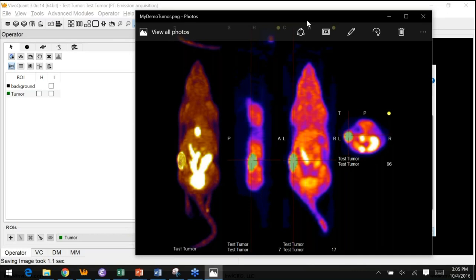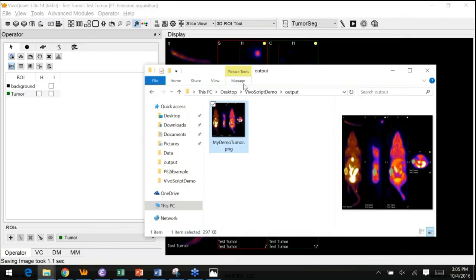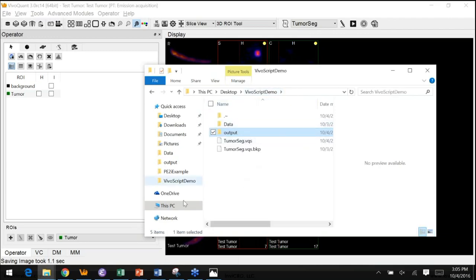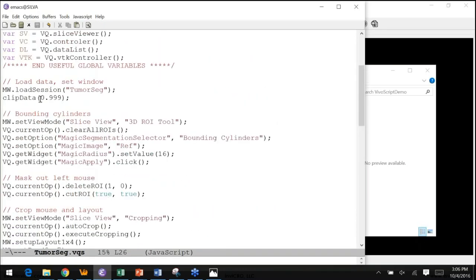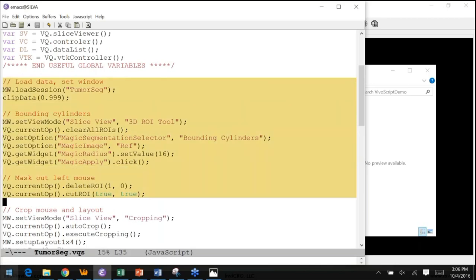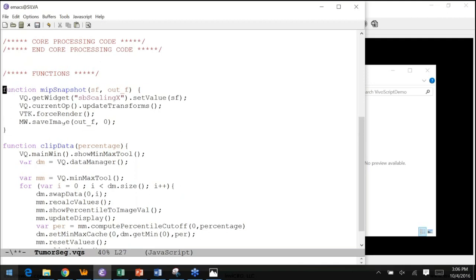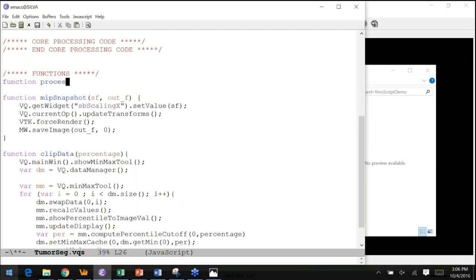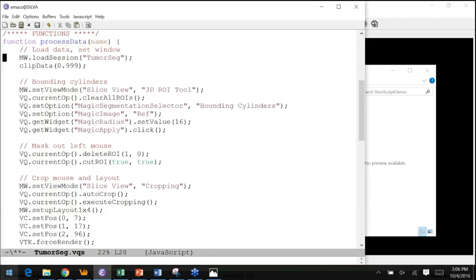Great. Does anyone have any questions or anything they're interested in seeing here that I didn't already do? So how would you get it connected? Is it possible to get multiple? Sure, yeah. I don't know if I loaded lots of data sets here, but it would look something like I would take everything that I just put here and either wrap it in a for loop or more nicely put it in a function. Say function process data set, and maybe you give it a name or something. And I put it all in here. So it's all living in this function now.